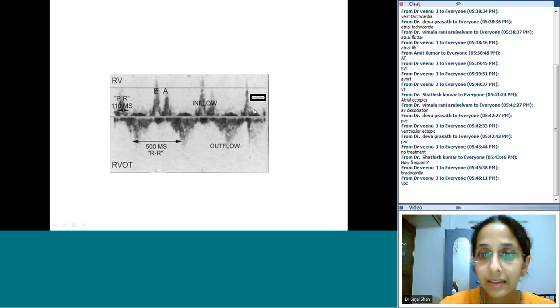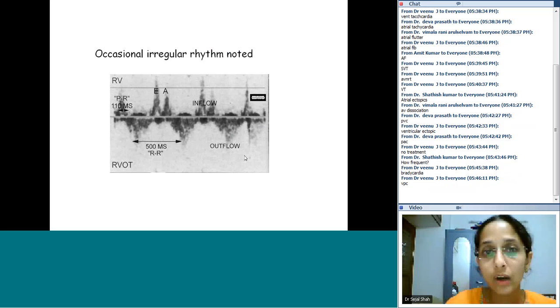So this is ventricular ectopic, and again we would screen out the structural heart problem. Otherwise, see how frequent they are happening. Yes, VPC. See how frequent they are happening and manage them closely if needed with normal function.